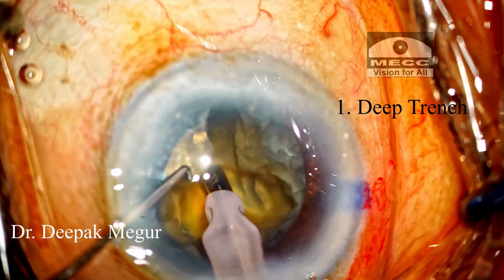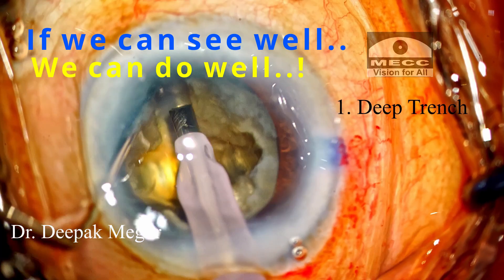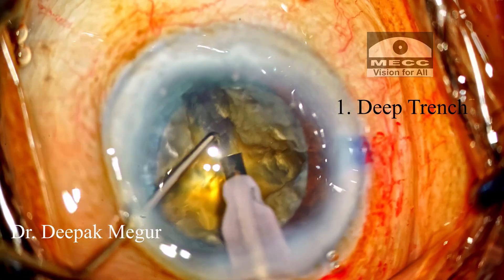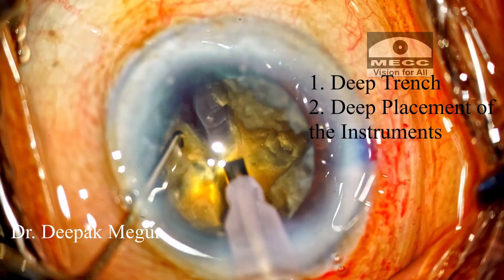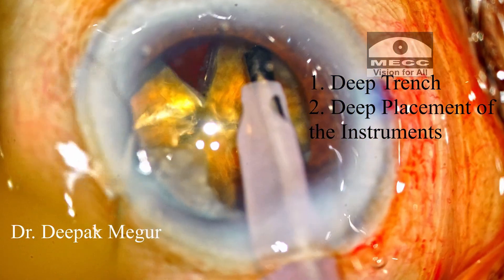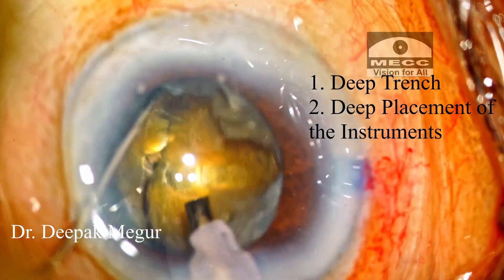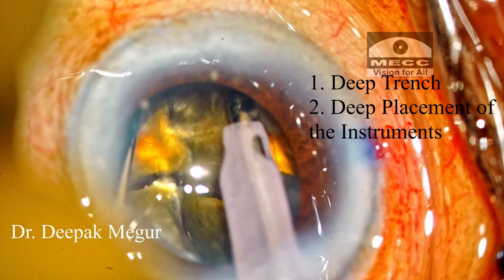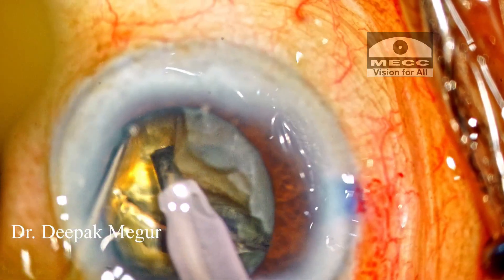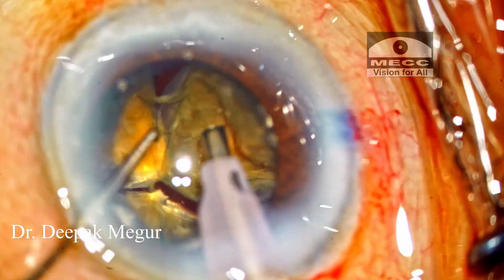This would be the basic principle for any surgery. I believe that if you can see well, you can do well. So first ask yourself: am I seeing well? Then proceed. Once we start seeing things clearly, we are very sure of placing the two instruments at the right plane — as deep as possible in the trench and just above the plane of intended fracture. Then the fracture of the posterior plate is induced effortlessly. The secret in these dense cataracts is to have adequately deep trenches and place the instruments at the right plane — as deep as possible — and then it's very easy to laterally separate them.